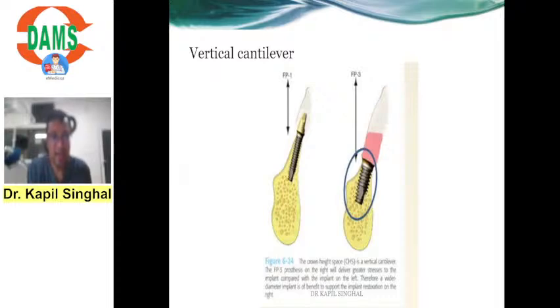That is why you have never heard my implant is tender on percussion, or that my implant has a sinus tract. Your implants will always have the crestal bone loss at the crest, whenever the forces are beyond the adaptive capacity of that implant, or whenever there is any peri-implantitis, the maximum bone loss is at the crest.